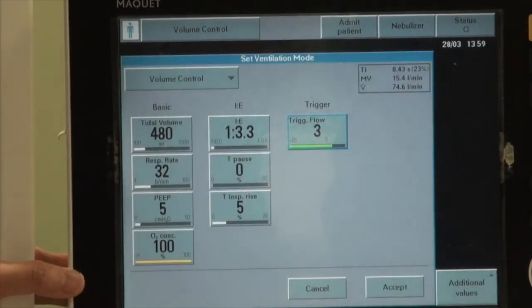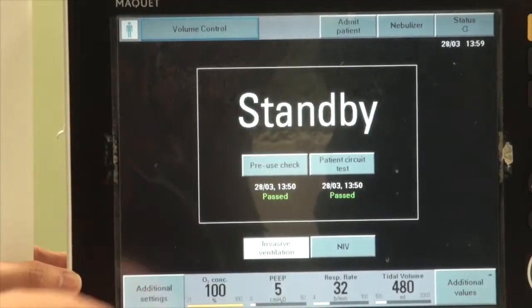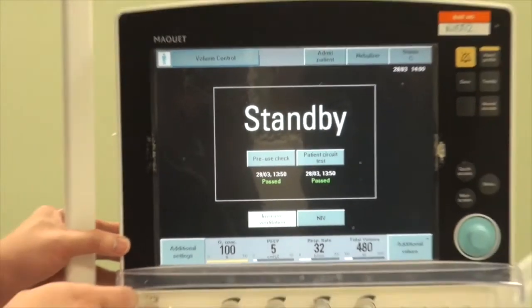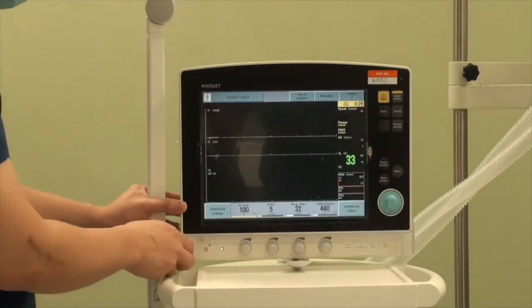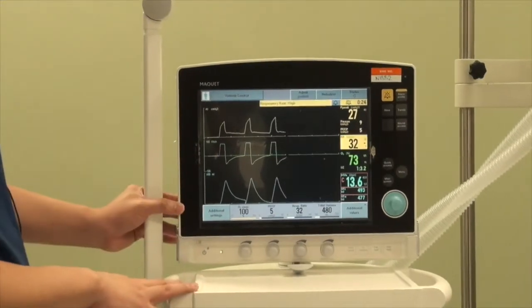Once everything is set and you are happy with the settings, press Accept to go back to standby mode. When you are ready to put the patient on the ventilator, press the standby button at the bottom left-hand corner and the ventilator will start delivering breaths to the patient.